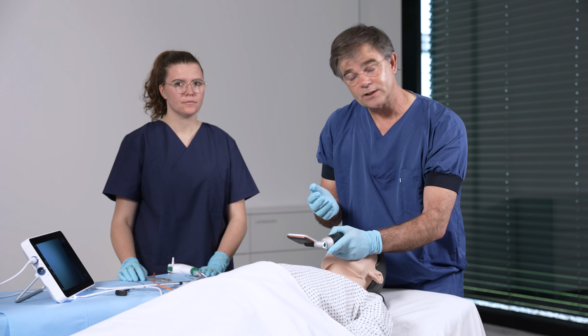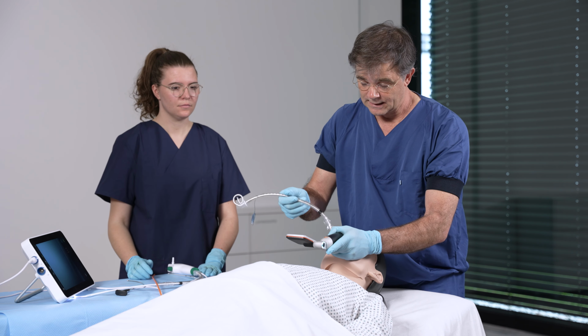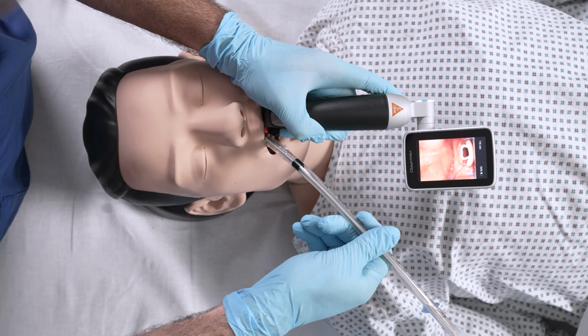But if I try to intubate now, can you give me the tube with a stylet in the tube? There may be a problem that I cannot intubate the glottis because the tube will not go anteriorly. So you can see it on the image. I've got a good view, but the tube will not go in. I cannot make the curve. And here we have the VAFI technique.